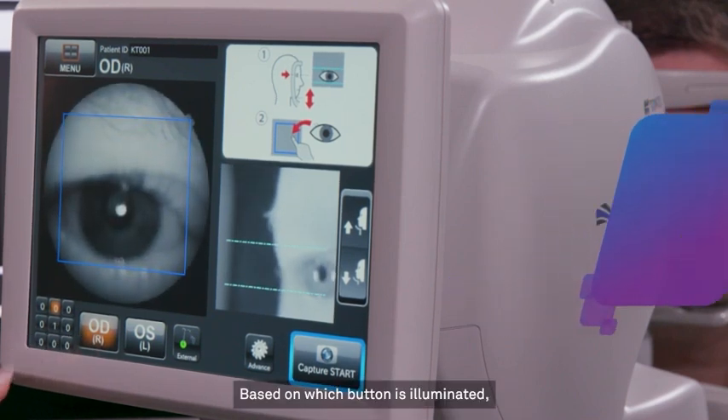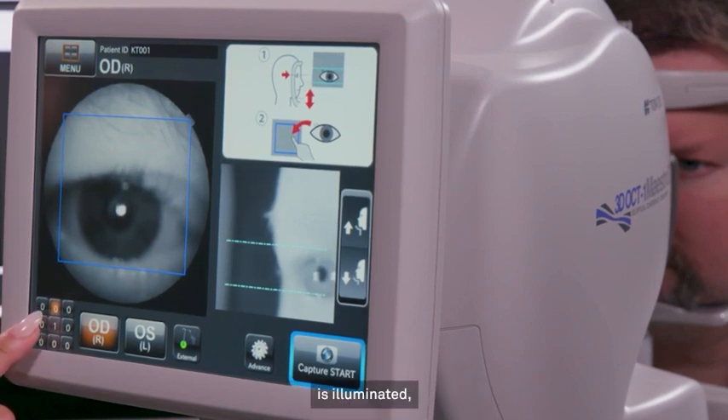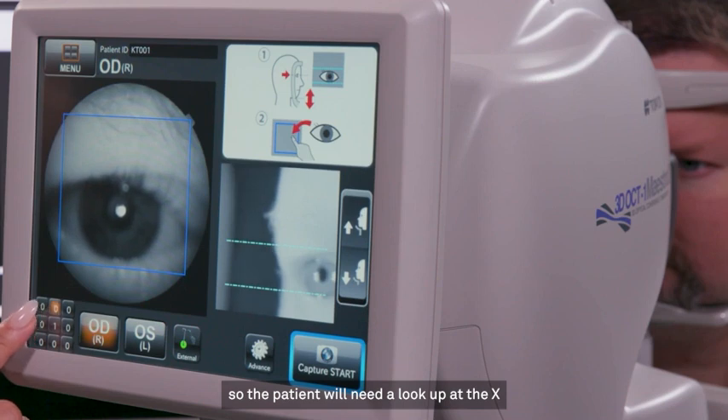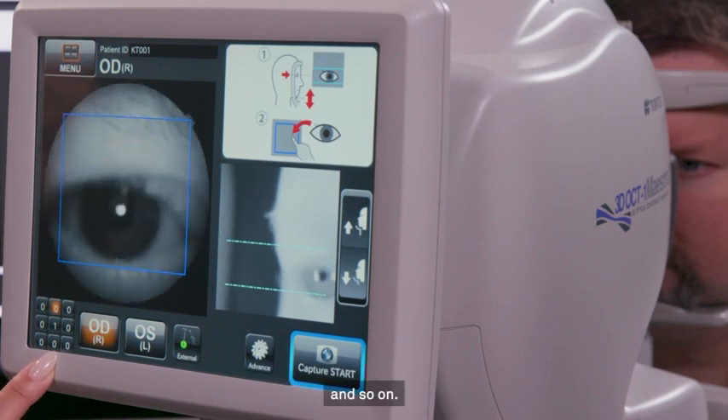Based on which button is illuminated, you'll know where to instruct the patient to look. For example, if the top middle button is illuminated, the patient will see the green X at the top of the inside of the lens, so the patient will need to look up at the X to make sure they're fixating properly. Likewise, if the bottom right button is illuminated, the patient will have to look at the bottom right to look at the green X and so on.